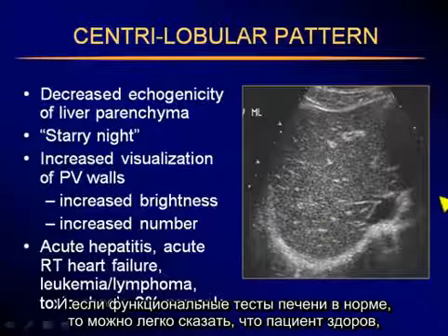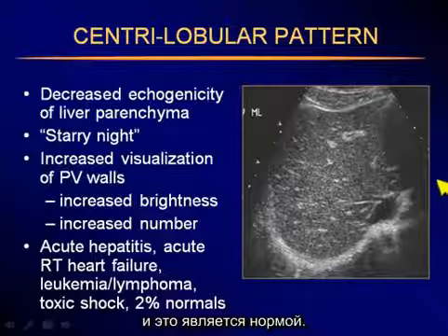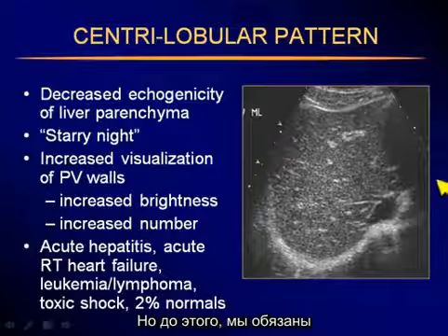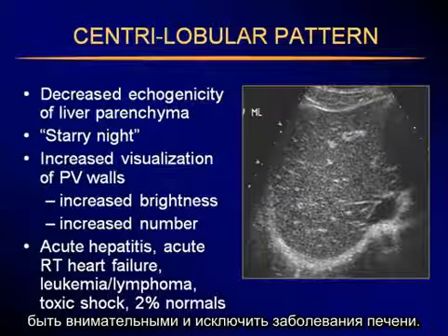That's easy to tell. The patient is healthy. There's no liver function test abnormalities, so those would be normals. Beyond that, we have to be cautious and rule out liver disease.